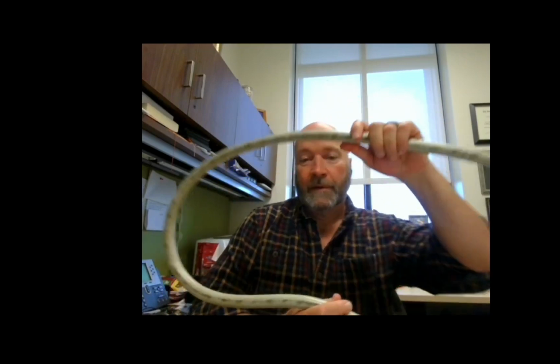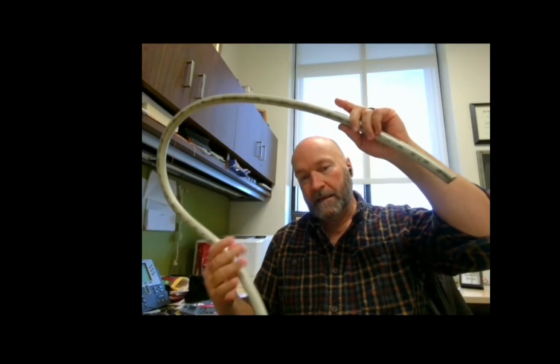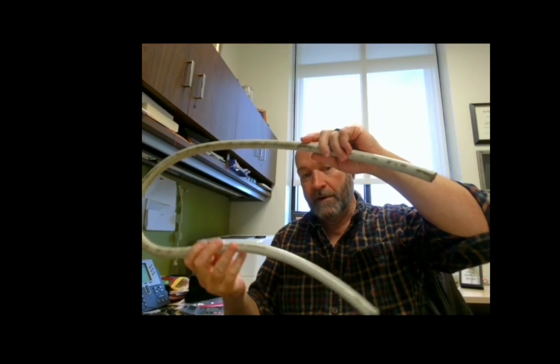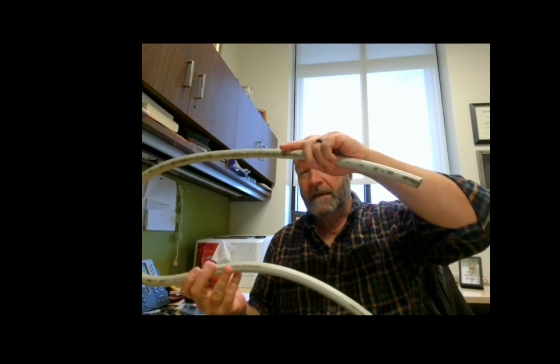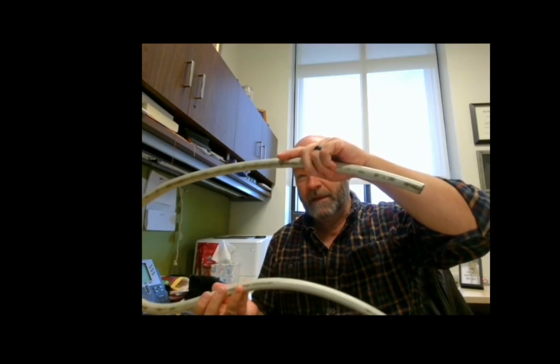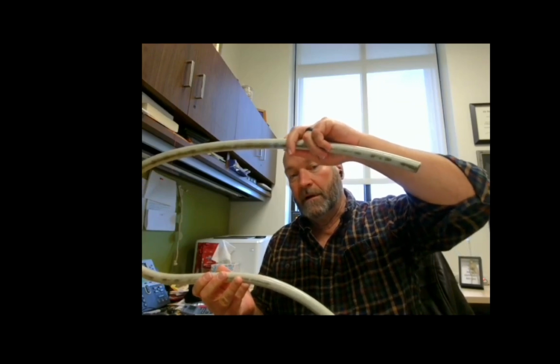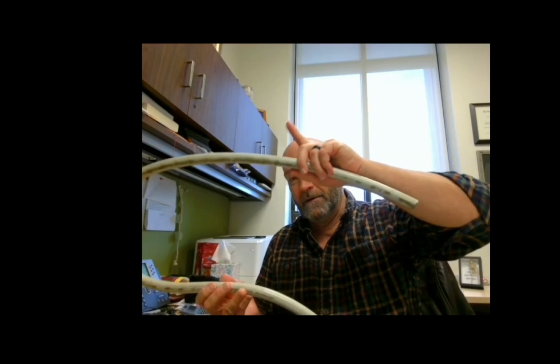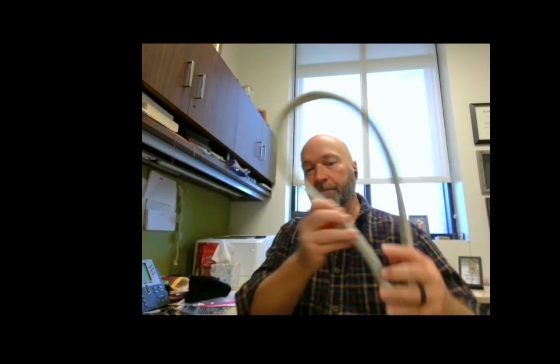Once we flip the patient over into right lateral, everything reverses. So this is my right hand side, so this is my ascending colon. I'm going to see barium on the lateral side of the ascending colon, and air on the medial side of the ascending colon. And then I'm going to see barium on the medial side of the descending colon, and air on the lateral side of the descending colon.